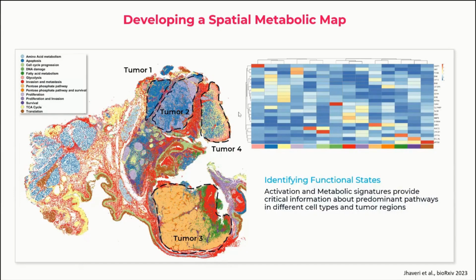So you can start to see the power of whole slide profiling of the tumor microenvironment and why we need to start to do whole slide imaging. It does become a cost limitation, but I think the biases you introduce in coring and creating tissue microarrays, or sampling them, mean you might miss a lot of the really interesting biology that's happening that we can't see.